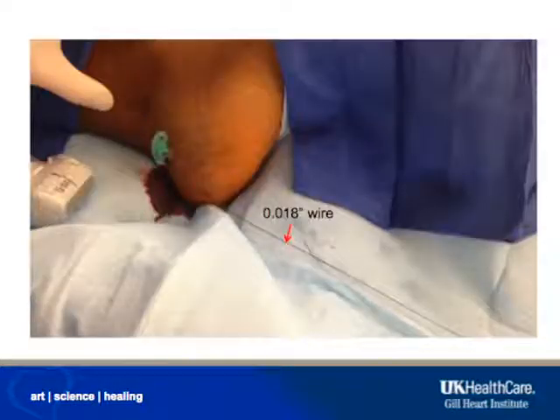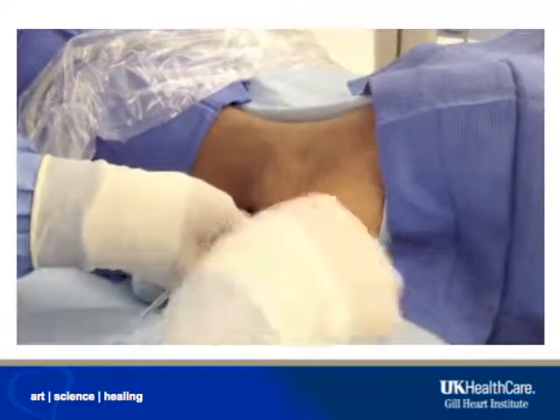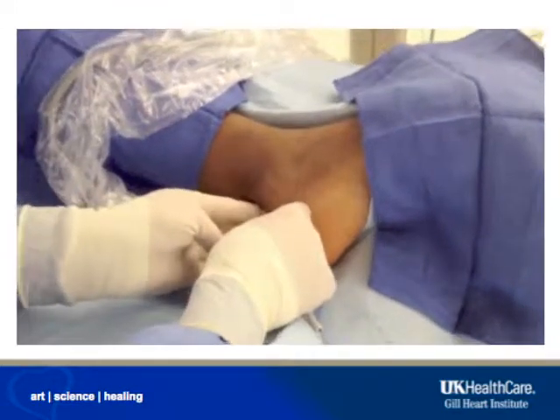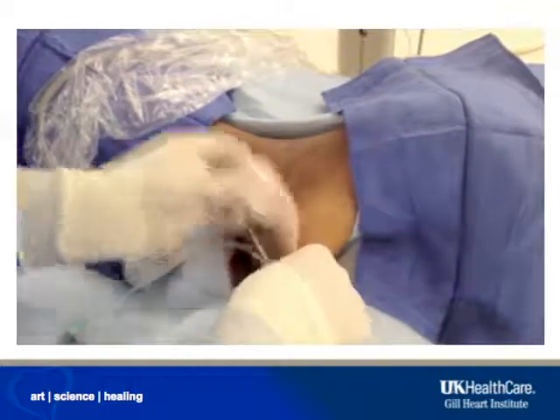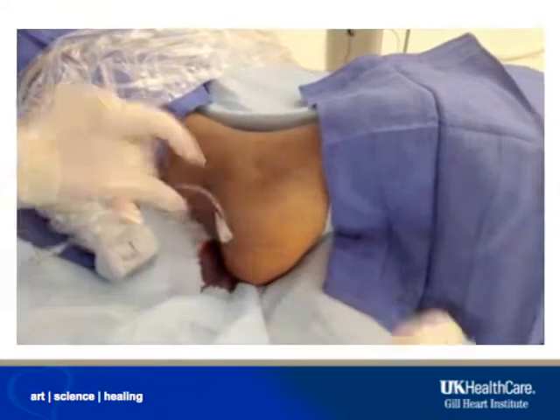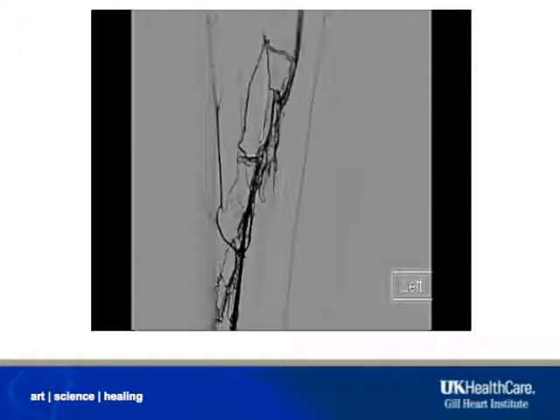A 0.018-inch wire can then be introduced into the vessel and directed under fluoroscopy or ultrasound until it is in a position to place a sheath. We typically use a short, hydrophilic sheath from 4 to 6 French for diagnostic purposes and 6 French for therapeutic procedures, which are advanced over the 0.018-inch wire. A simple hand injection of contrast under cine angiography can then be used to define the lower extremity venous anatomy, serving as a roadmap for the advancement of wires and catheters.